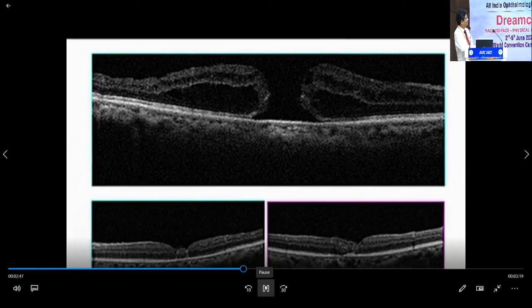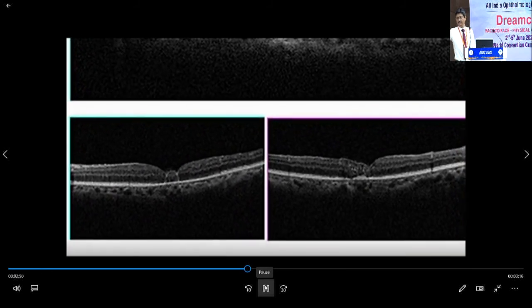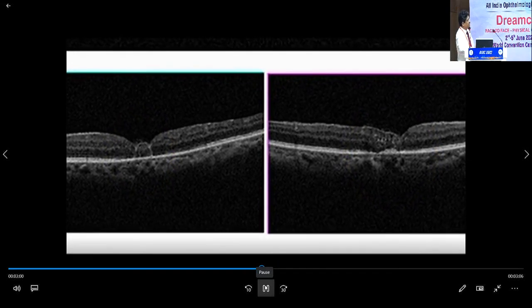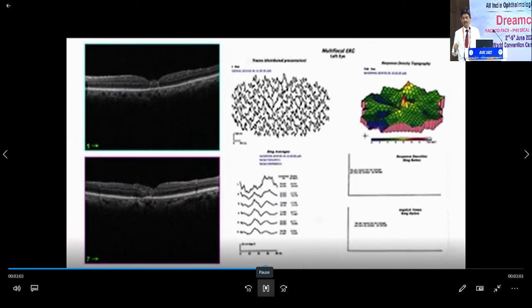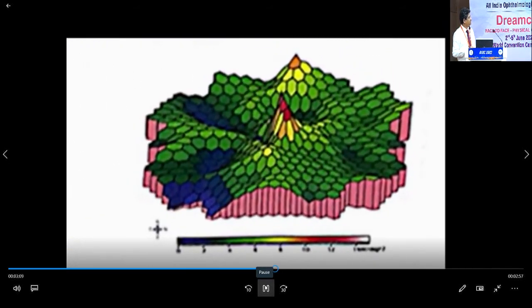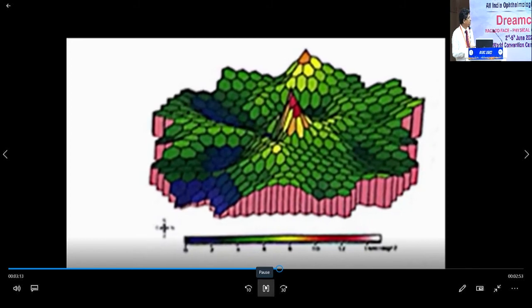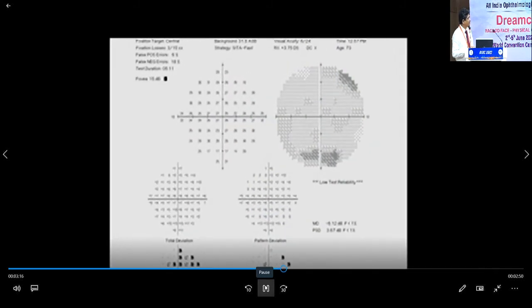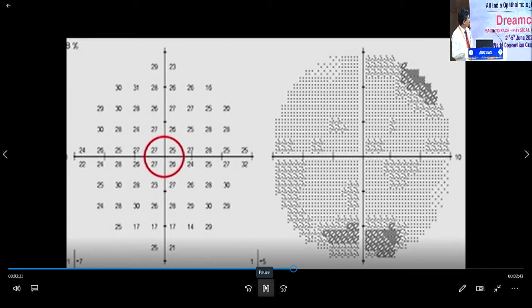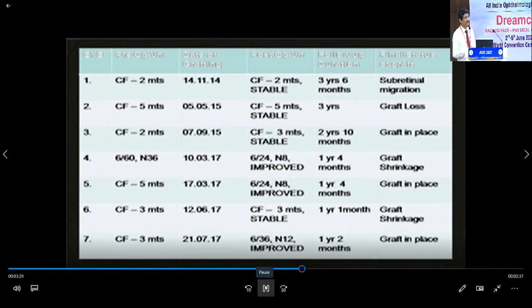This is the failed surgery — the OCT above — and this is the graft tissue lying there, which has a little bit of similar retinal architecture. With this inspiration, we started going forward. This is the anatomical success we have achieved. For functional assessment, we did multifocal ERG for these cases and you can see there is a significant spike still visible. Since we don't have microperimetry, we used standard visual field 10-2 test, and the central area is doing almost 25 to 26 dB — which is significantly high. So the graft is actually functioning.